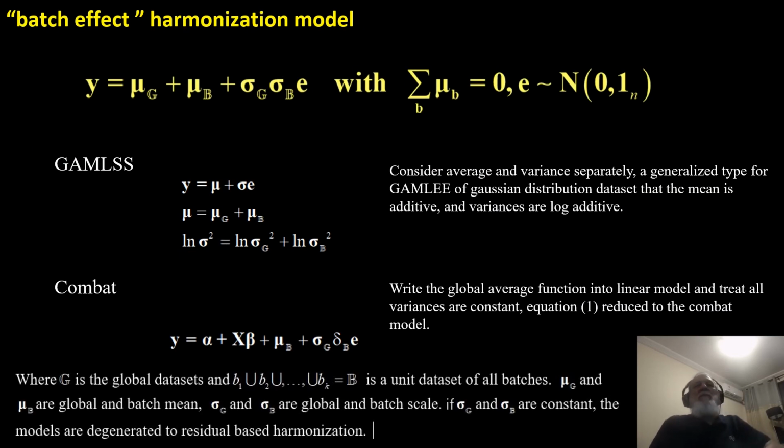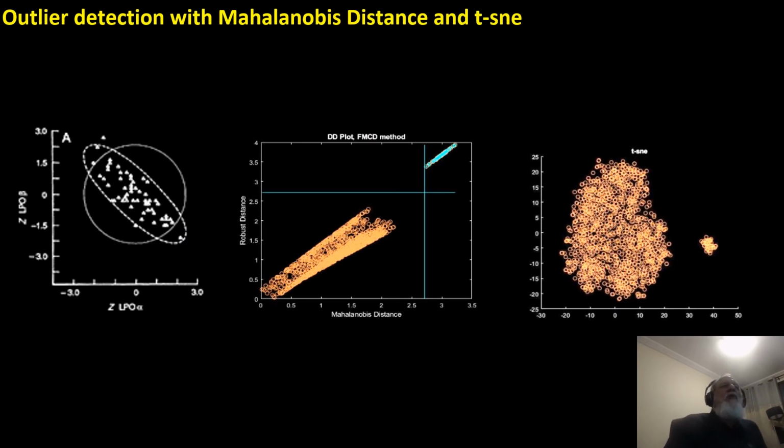This is the model we used. It's based on functional data analysis using Nadaraya-Watson kernel regression. And it's essentially an ANOVA decomposition that takes into consideration factors like frequency, sex, global batch effects. I'm not going to go into details. And we then went on to do outlier detection using both the Mahalanobis distance versus the robust distance. We would find certain outliers, and that would allow us to go and check back without people having to show us their data.